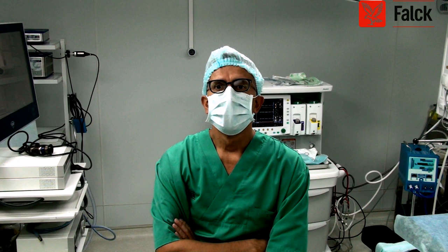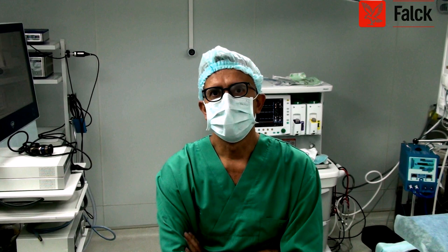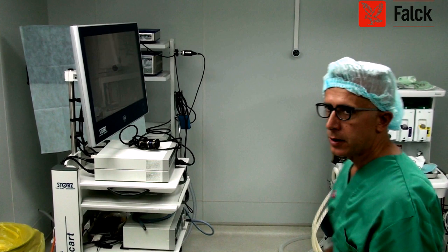Is the translator, the interpreter present? Is she present? She's having a conversation. Dr. Gillifan has not yet arrived, but I think that I can explain some characteristics of this Storz camera.